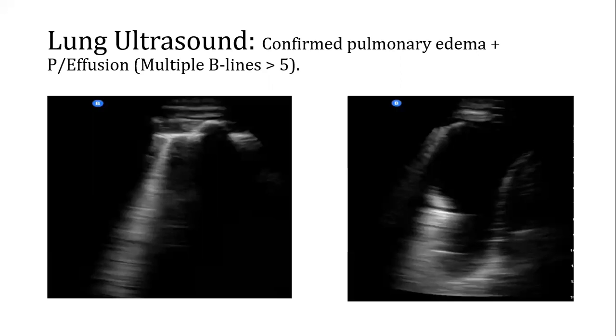Now, on lung ultrasound, what are we looking for? In lung ultrasound, we basically use artifacts to tell pathologies. There are over 10 artifacts, which we'll discuss later, not in this presentation, and we'll see their appearances. But particularly for this presentation, you see this hyperechogenic vertical artifact. This is what we use if we want to tell there is pulmonary edema.